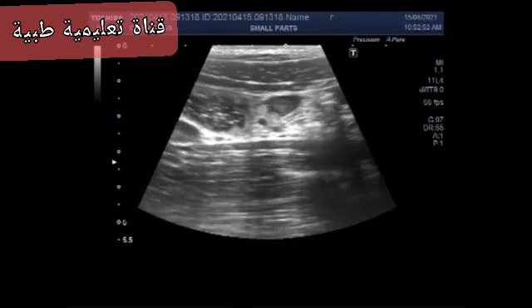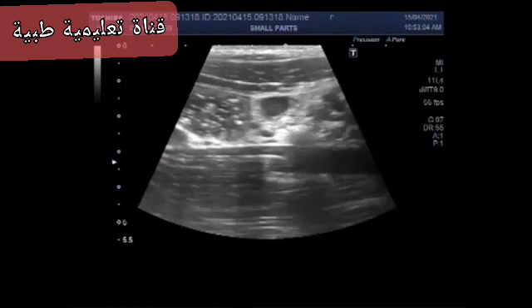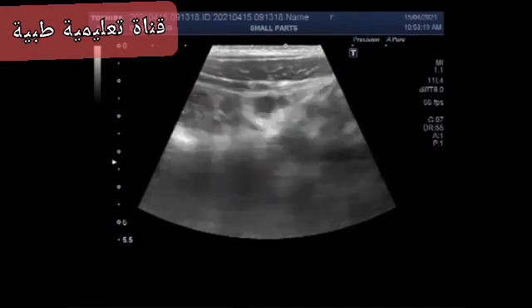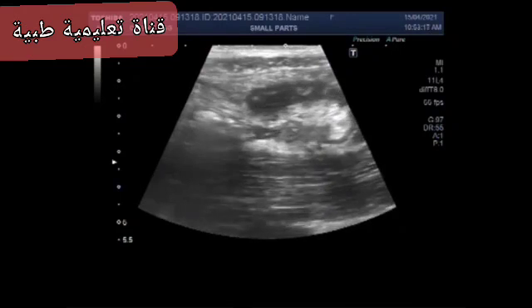Now you can see another lymph node near the cecum and the omentum. The appendix is a small pouch-like sac of tissue that is located in the first part of the colon, called the cecum, in the lower right abdomen. Now you can see the inflamed appendix.